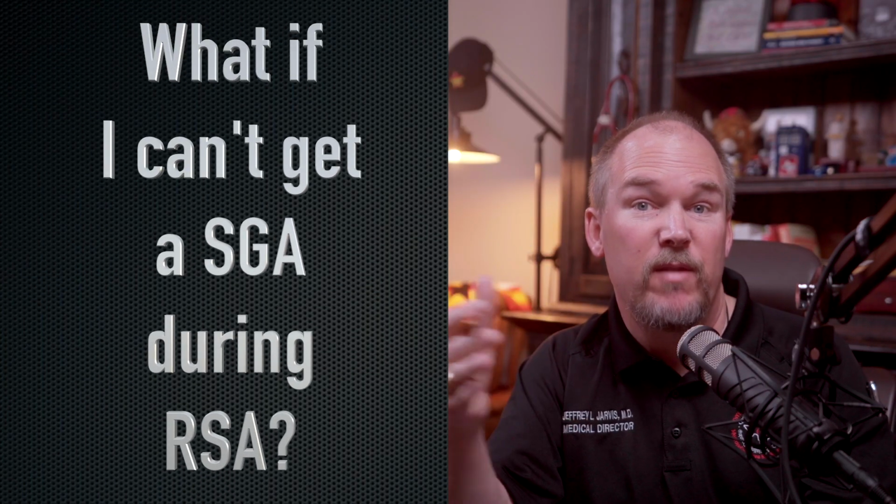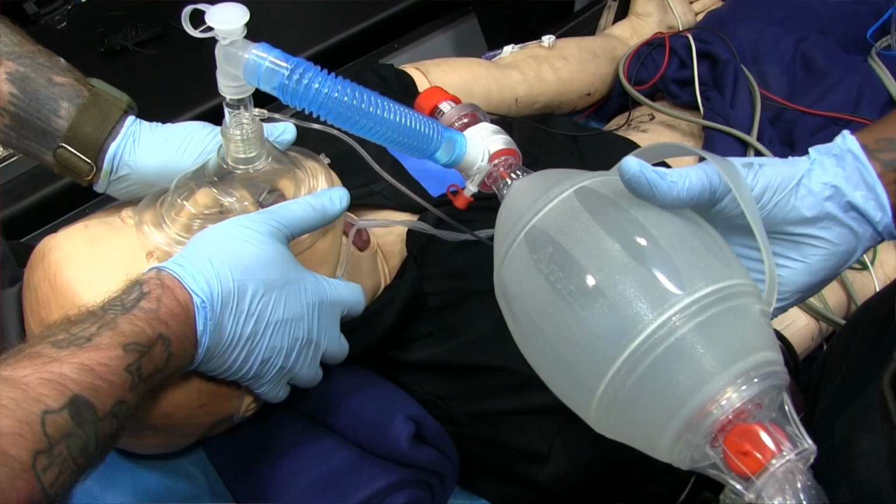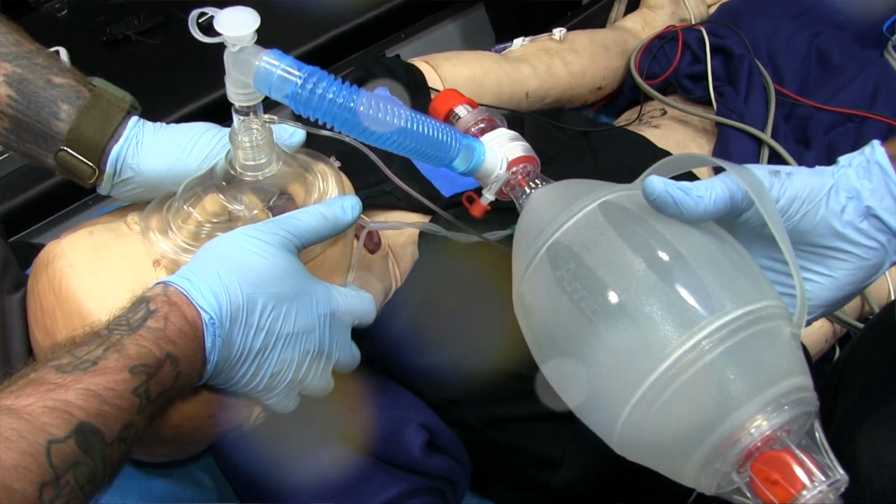All right, another question. What should I do if I fail to successfully place a supraglottic during RSA? Well, first consider re-oxygenating with a mask and then attempting another supraglottic, but do something differently. A different size supraglottic, a different technique, a different clinician. Change something. Now, there's no magic number of how many attempts you have after a supraglottic, but after 2, just like with intubation, I'm highly suspicious you're not going to be successful with a 3rd attempt or a 4th attempt or a 5th attempt. Recognize that it's not working, move on to something else.